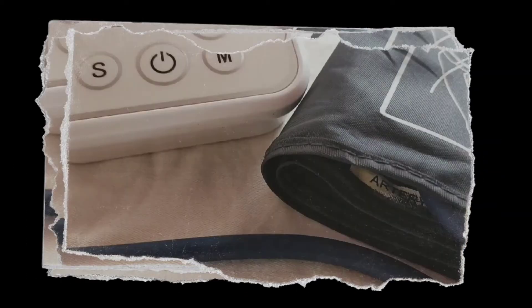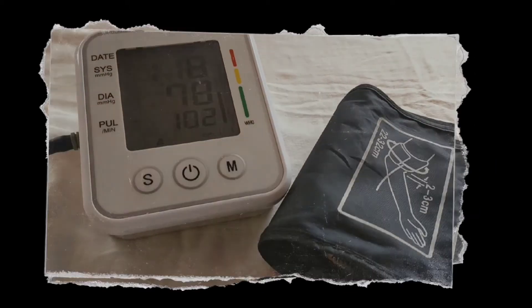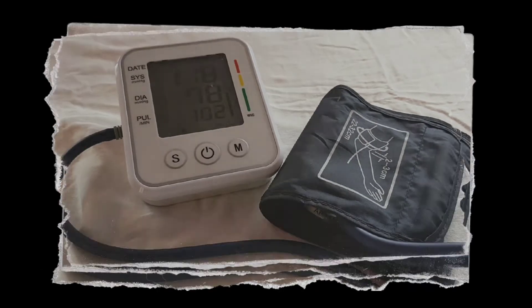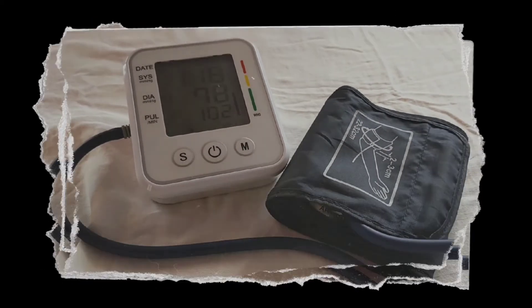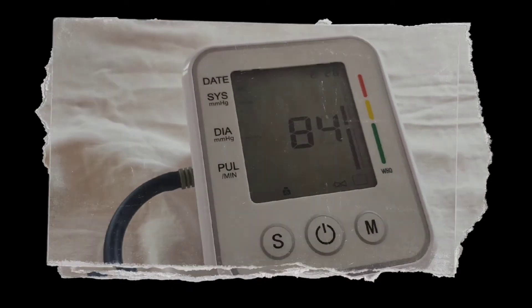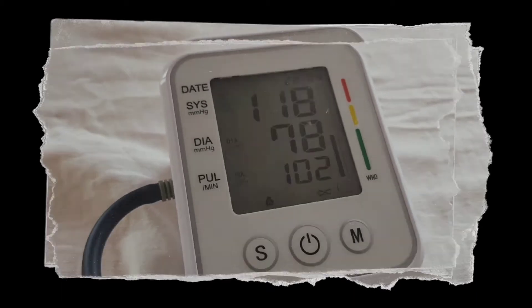Digital blood pressure monitors are popular for measuring blood pressure and are often easier to use than manual units. A blood pressure monitor is a fully or semi-automated, simple, lightweight machine used for measuring blood pressure and pulse quickly. It is easy to use, reliable, and portable.